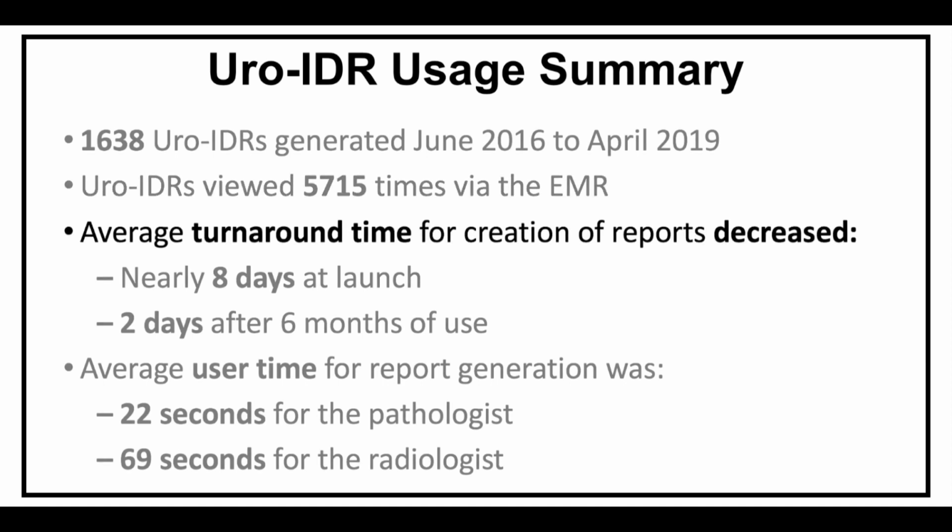The average turnaround time for the creation of an individual report decreased from nearly 8 days at the time of its launch to 2 days after 6 months of use. The average user time for report generation was 22 seconds for the pathologist and 69 seconds for the radiologist.